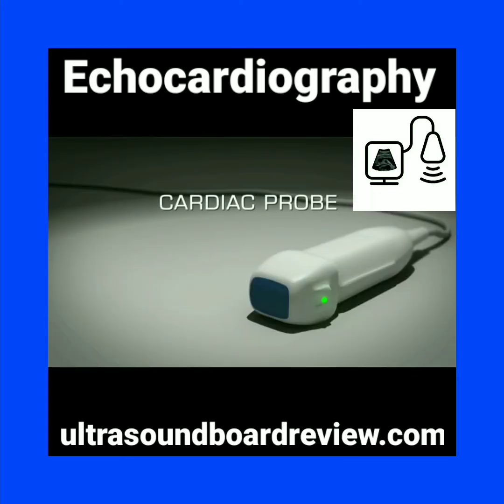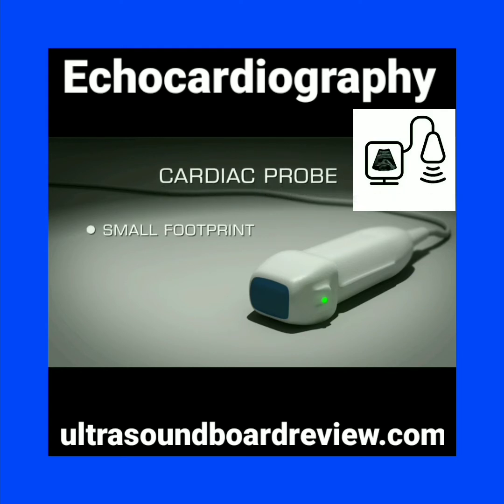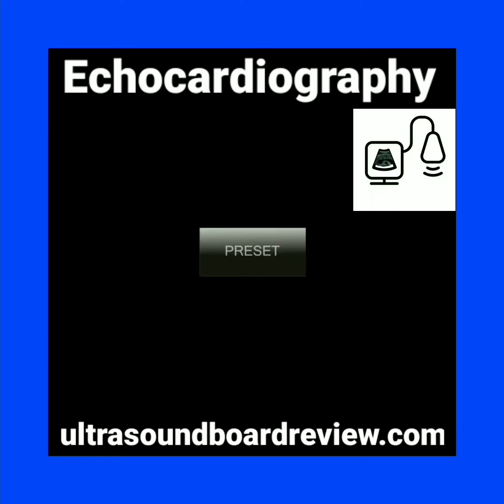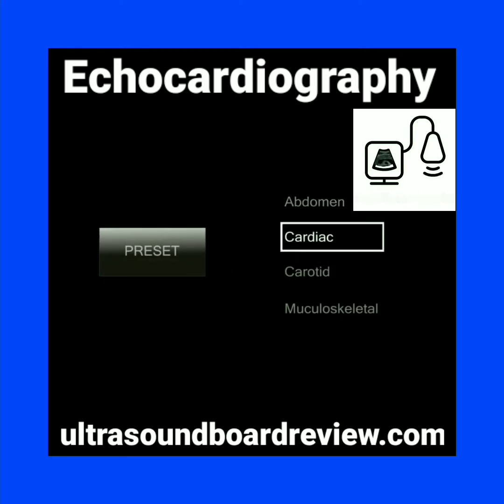Attach a probe suitable for cardiac imaging to the ultrasound device. It should have a small footprint, a sector display format, and a frequency range of 1.5 to 3.6 MHz. Select the cardiac preset on the ultrasound device.